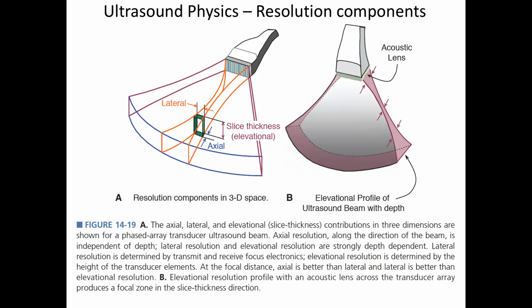So you can carve it down smaller and thicker to make that crystal resonate at higher and lower frequencies. One mode of imaging is to create a set of vibrations from these crystals, simultaneously phase delay them such that you get a focal point at a specific depth. And you can raster that focal point up and down if you want by changing those phases.